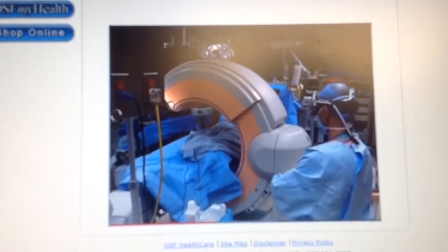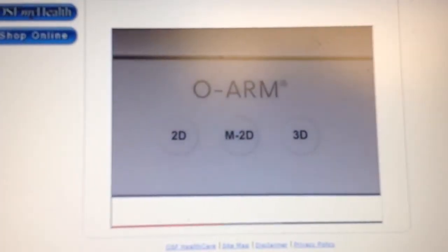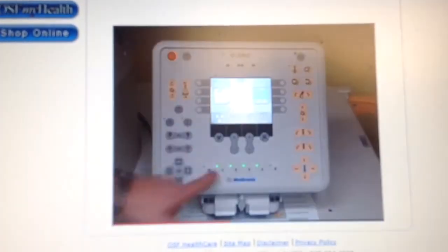There's probably a couple of scenarios that this technology is ideal for. One would be that patient with a very complex spinal deformity. A normal patient, we look at this anatomy every day, and we know exactly where the screws go, and it's a very short and quick surgery in that way.